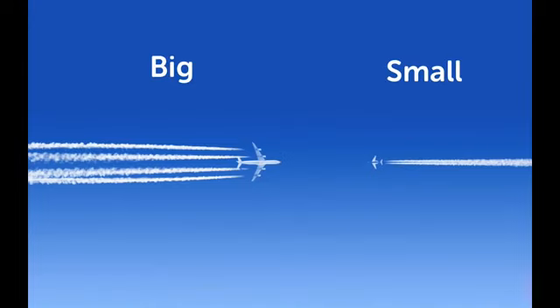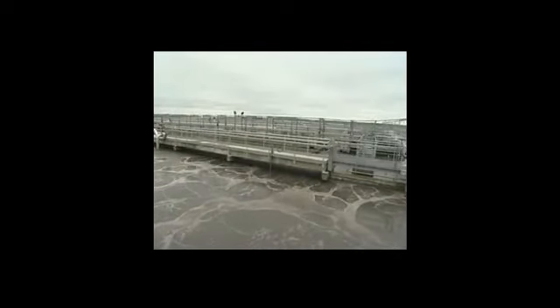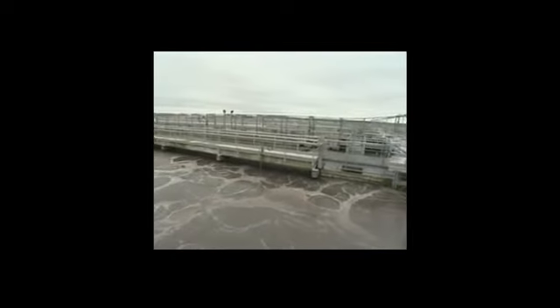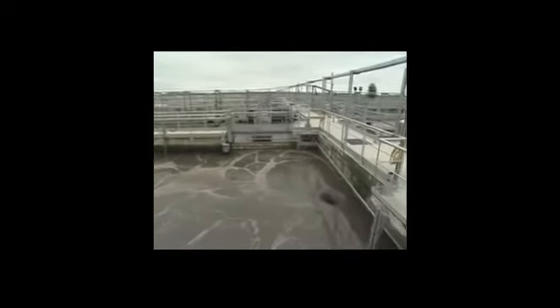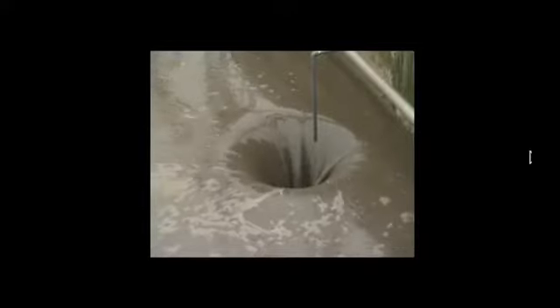However, there's one component of the jet which is especially important, and this is the so-called flow convergence zone. Here's an explanation of what the flow convergence zone is. Take a look at this water plant, and specifically at the hole right here, and watch how the water flows. As the water comes towards this hole, its velocity increases, and the area of high velocity will be larger if the hole is larger.